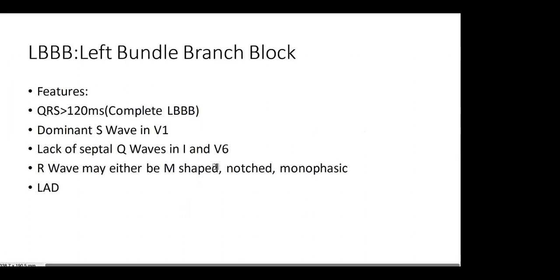And Daniel, after I'm done presenting the pathophysiology, I would want you to expound more on this, because a left bundle branch block sometimes equates to a heart attack, and that's why somebody has to take it very seriously. More so if you have two ECGs.